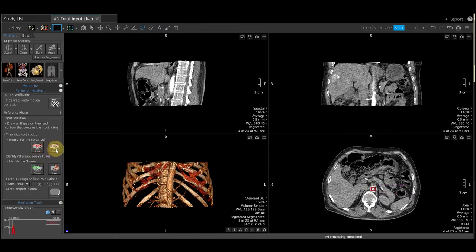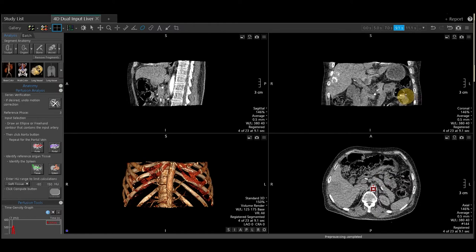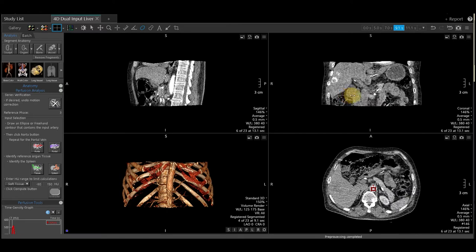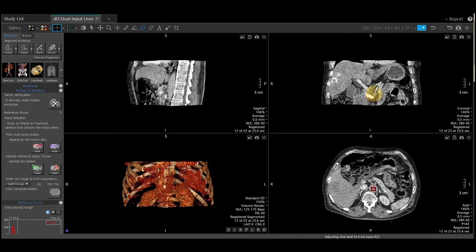We will do the same for the portal vein. You can do that either on the axial or coronal image. Once you locate the portal vein, by holding your right mouse down, you can scroll to where there is contrast in the portal vein. Draw your region of interest and select portal vein.